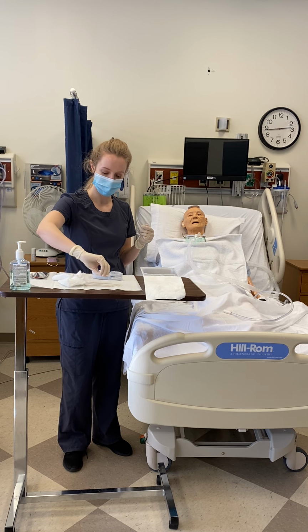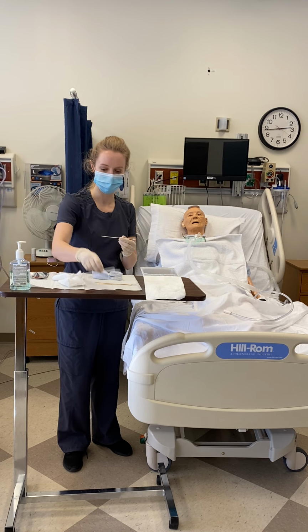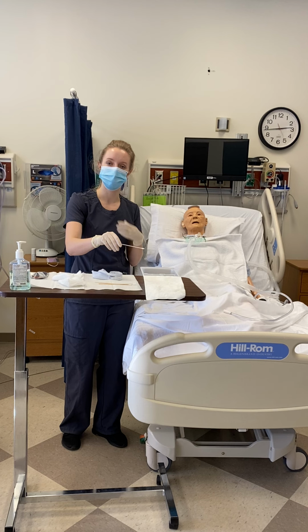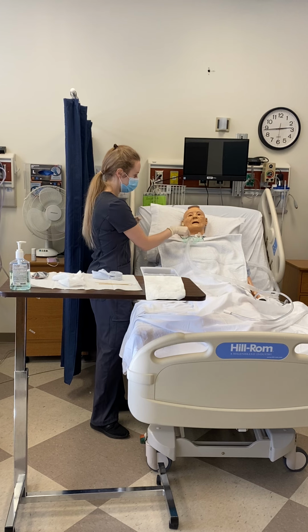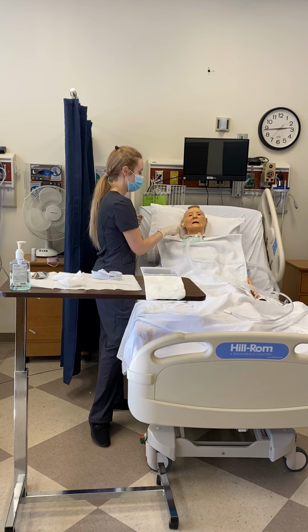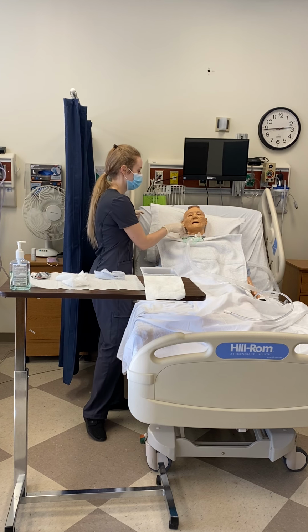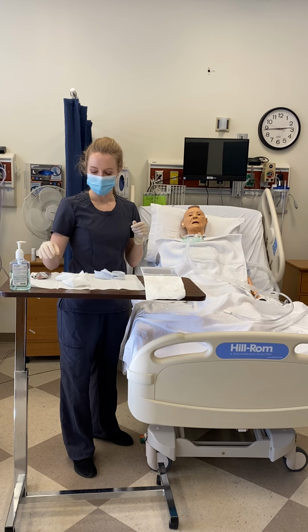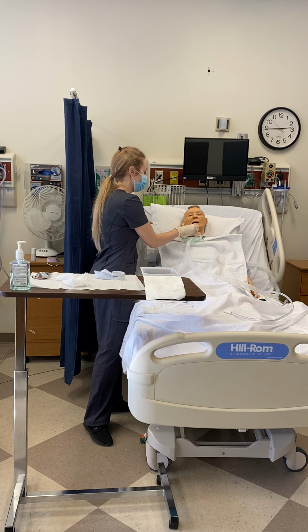I then take my swabs, and one at a time, I would not want that to touch. One at a time, I dip them in saline. I could use some hydrogen peroxide as well if they're crusty secretions. And I clean around super well, using each one once and then discarding, saline, discarding, maybe saline and peroxide. Here, cleaning, discarding, and then I will take some gauze in saline and clean around.